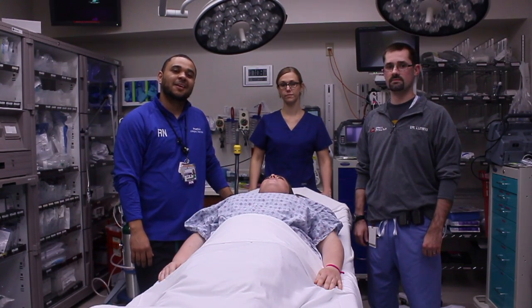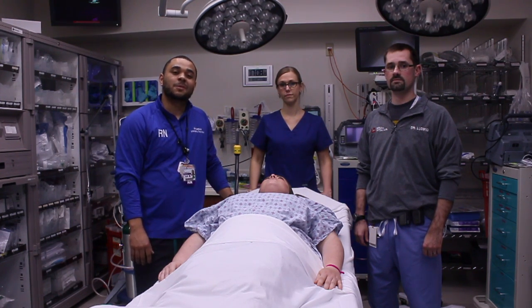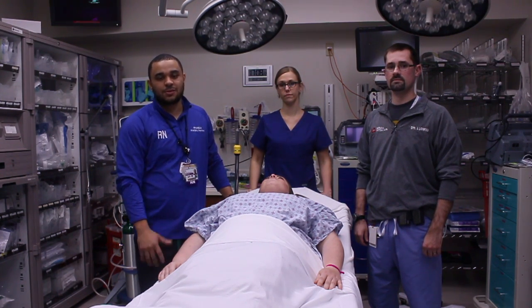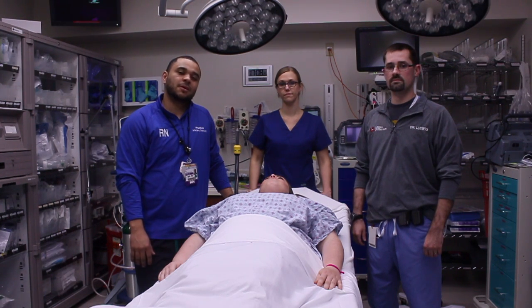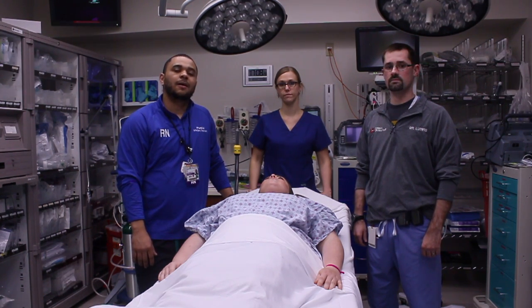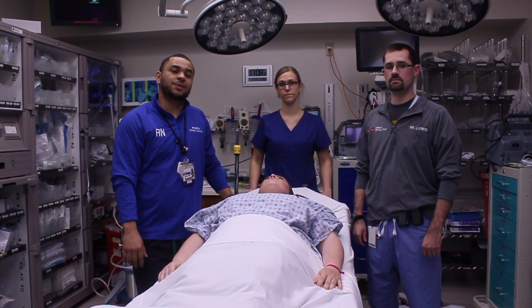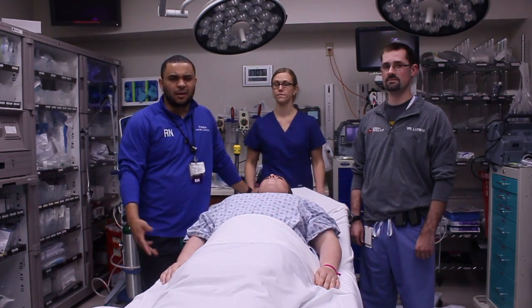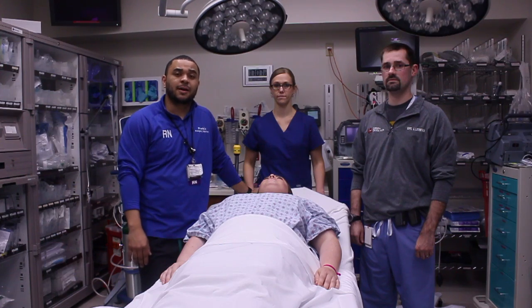In the episode today, we're going to talk about ED thoracotomy. We're going to talk about the indications, the contraindications, and the cautions when we perform this procedure. Also, we will discuss the equipment that is needed and where to find the equipment in the trauma bay. Some of the procedural steps are critical for this procedure, including internal defibrillation and where to find those paddles.